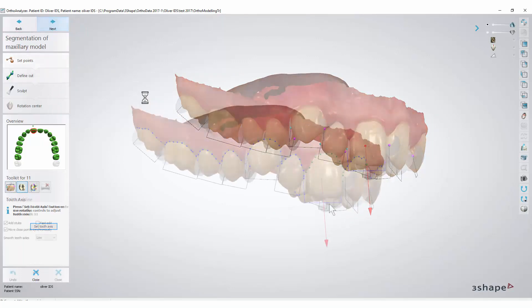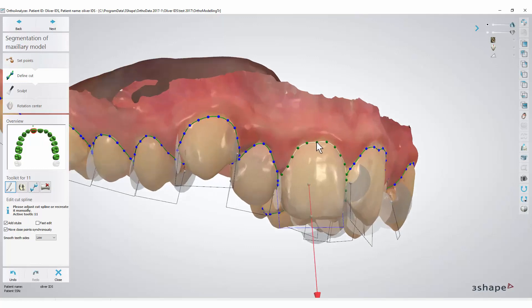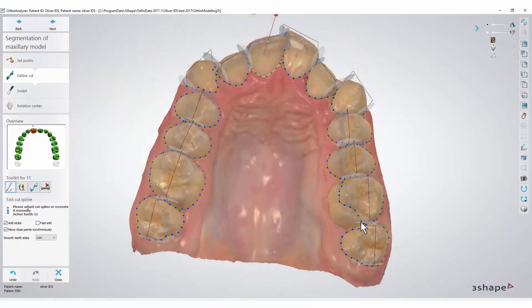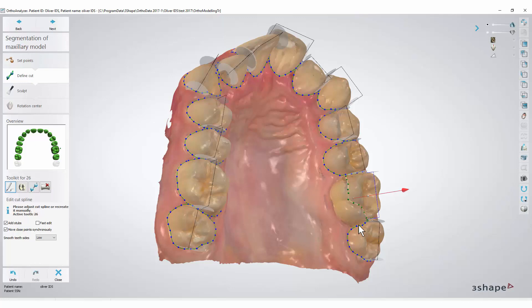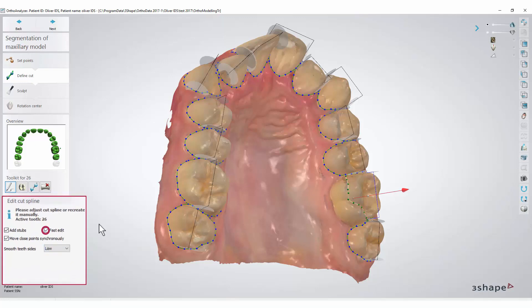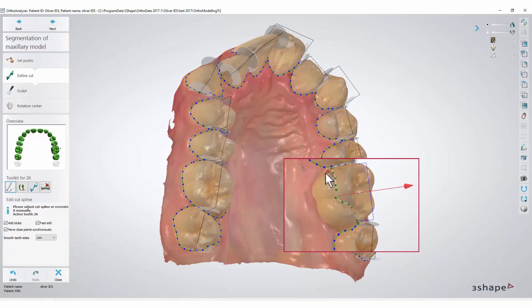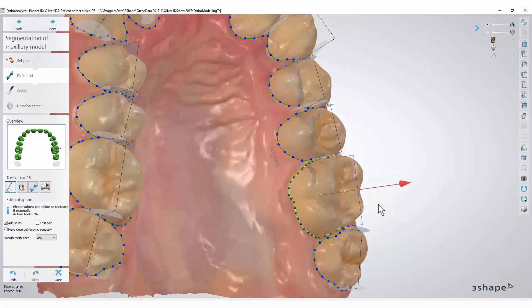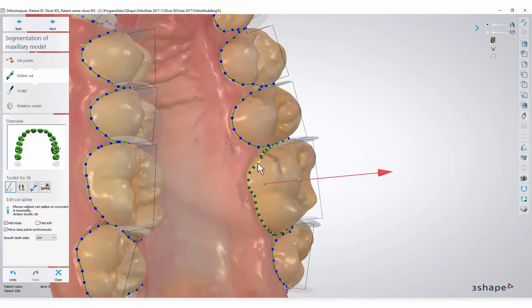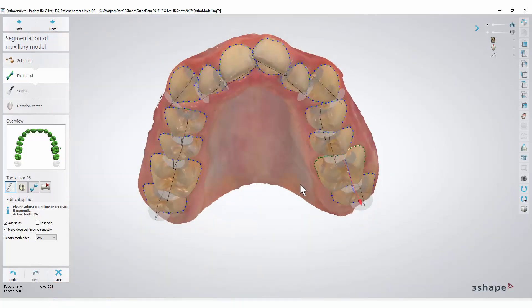The software automatically defines the line between gingiva and teeth. If you are not satisfied with the spline line, you can either go one step back and change the direction of the root, or you can manually change the spline line. Enable the Fast Edit option in the Edit Cut Spline section — now you will be able to draw the spline line with your cursor exactly where you wish it to be. If you disable the Fast Edit option, you can make changes to this line by grabbing and moving the control points. Once you are satisfied, press Next.